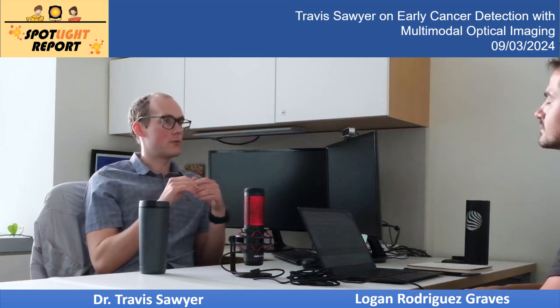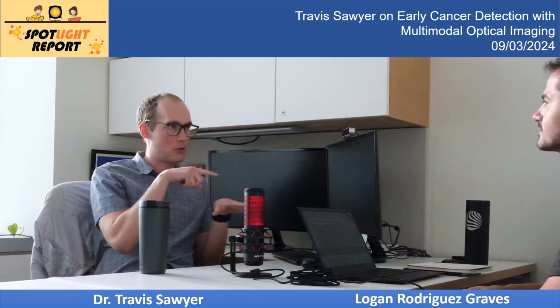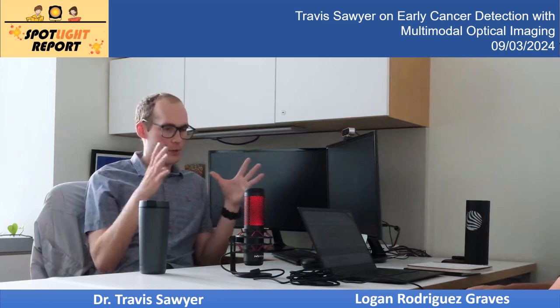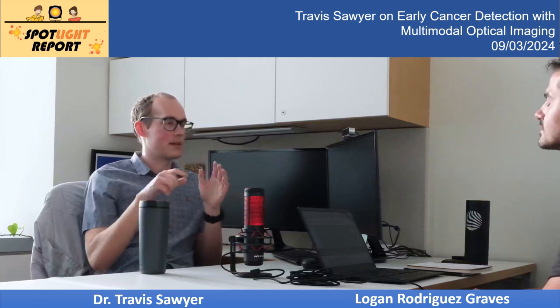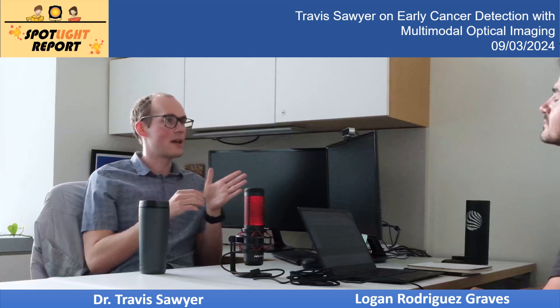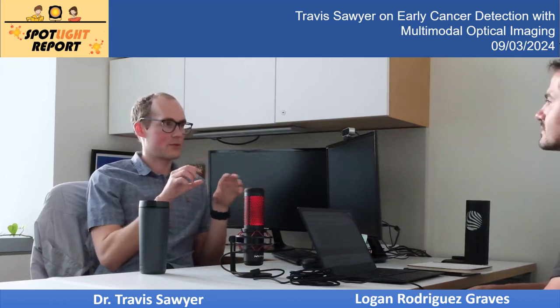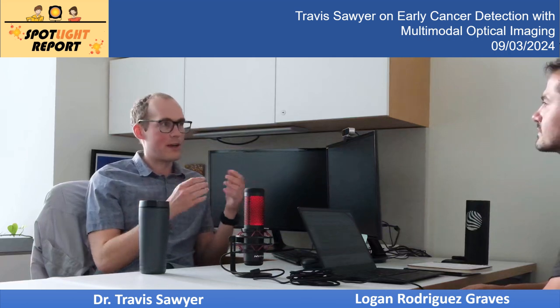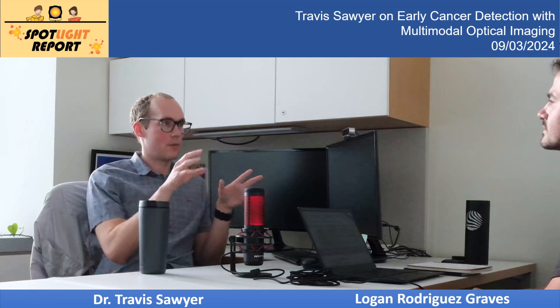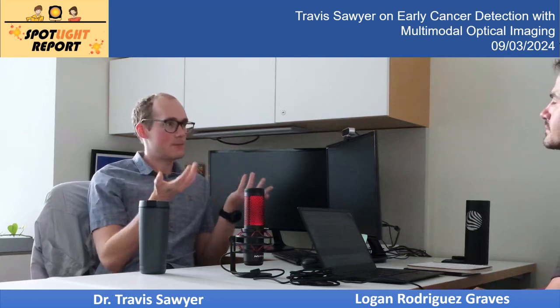Something we looked into for OCT is essentially called the texture of the image. And so it's kind of the local variation in brightness. So if you have a bunch of cells packed together, it's going to be really bright for a while because it's like really high contrast. But then if you have voids, which you do have in ovaries, they're essentially where the eggs grow, you're going to have a dip and go back. And so we were trying to quantify that to give us these numbers that represented what our eyes are actually seeing. And so that's feature extraction.